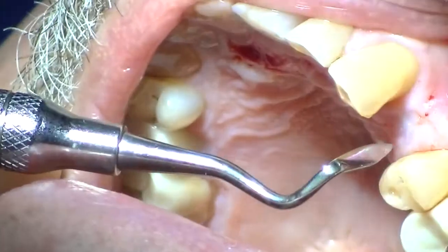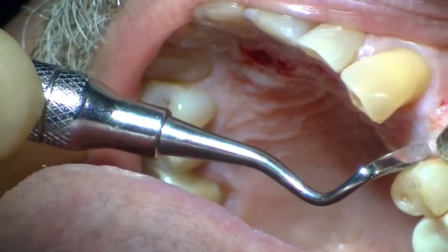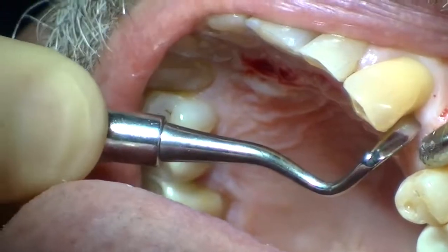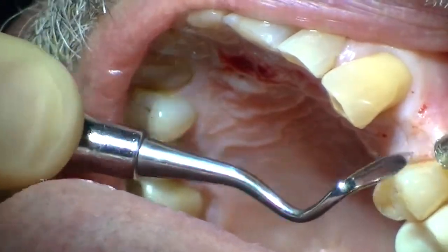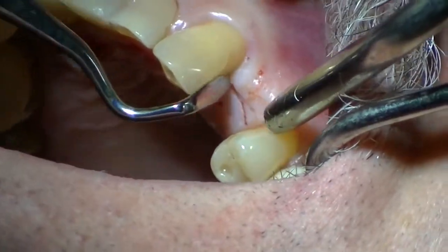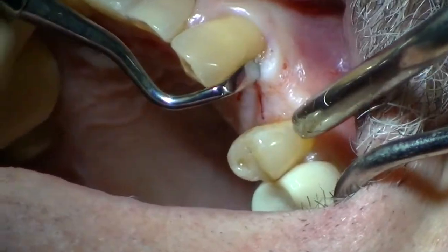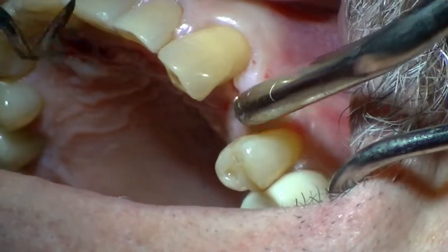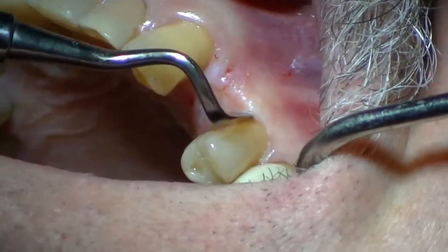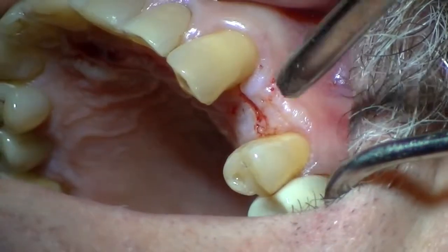And I'm going to make a crestal incision to hard tissue, to the adjacent tooth. Nice clean incision. And because we're not going to make any vertical incisions, we're going to go around the tooth about halfway. We're going to try to stay away from the mucogingival line. We're not making any vertical incisions, which will eliminate prostaglandin and histamine release.